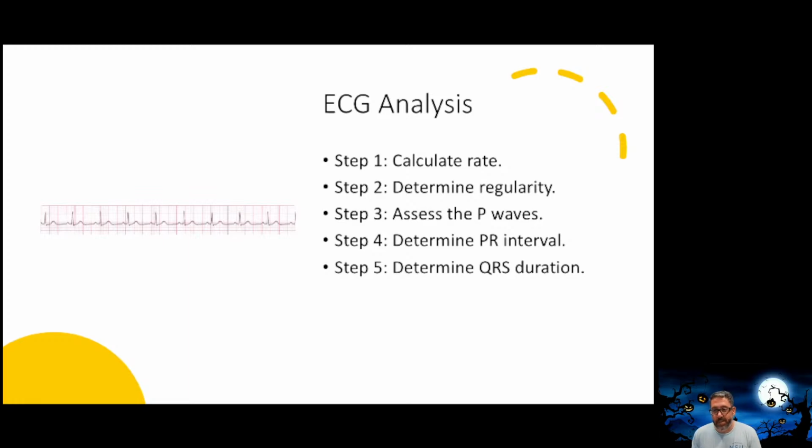So, ECG analysis. Everything you do the first time you see an EKG, whether it's a rhythm strip or a 12 lead, first thing is look at the rate. What's the rate? Okay, there's many different ways to do it. Then we look at the regularity. Are the P waves marching out regularly? Are the QRS complexes marching out regularly as you go across from this one to this one to this one to this one? They should be regular and even. Remember the cardiac cycle. We went over that many times in physio and pathophys. You got 1 second to get everything done in a 60 beats per minute heart rate. So you should have regularity between the P waves, if you march out every P wave, and regularity between every single QRS complex. So we look at that.